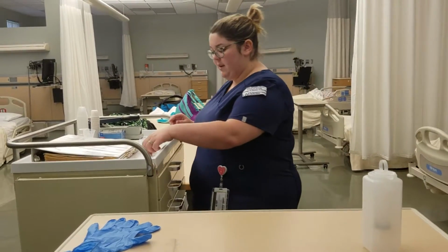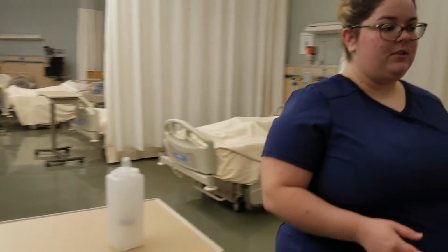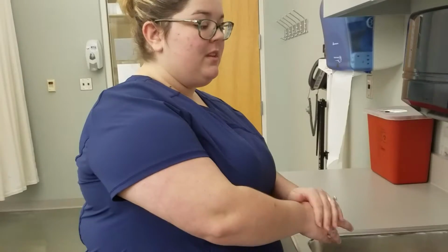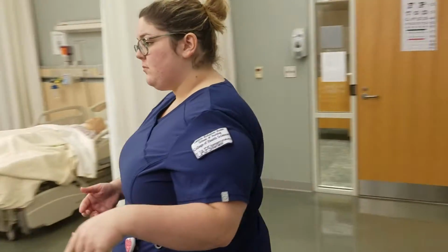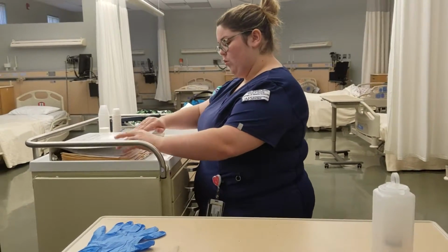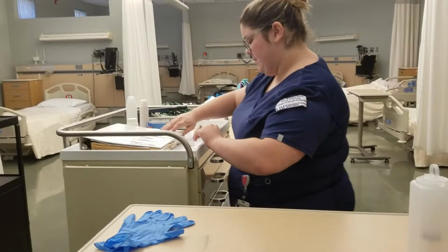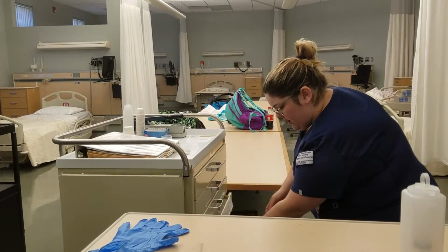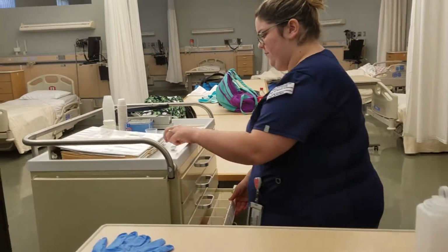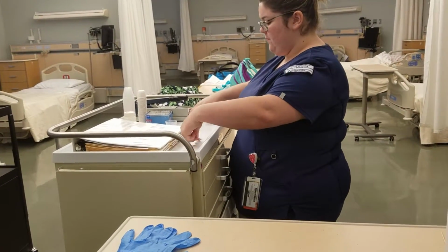Now I'm going to prepare my medication, acetaminophen. I'm going to go ahead and wash my hands first and perform hand hygiene. And then I'm going to check my medication ordered by my doctor against my MAR. And it's 500 milligrams of acetaminophen. So I'm going to get out my medication and I'm going to pop it into my cup.